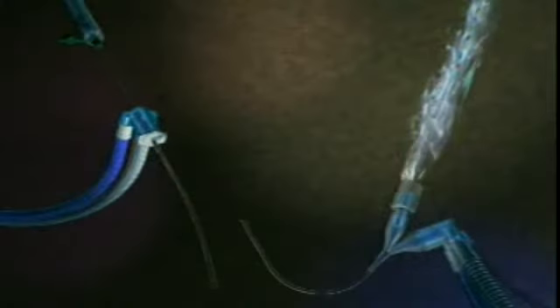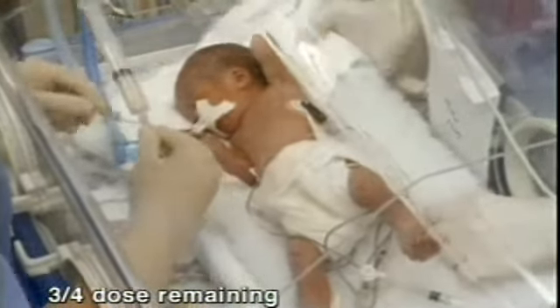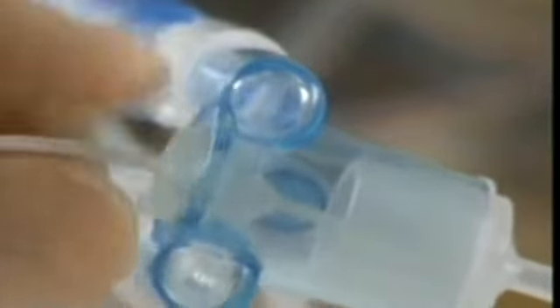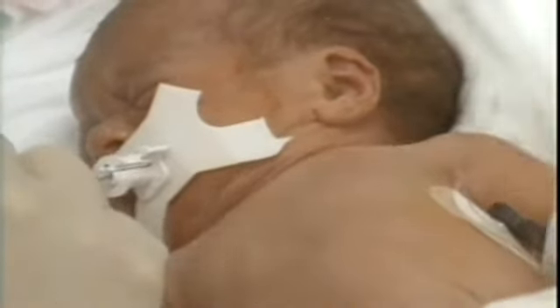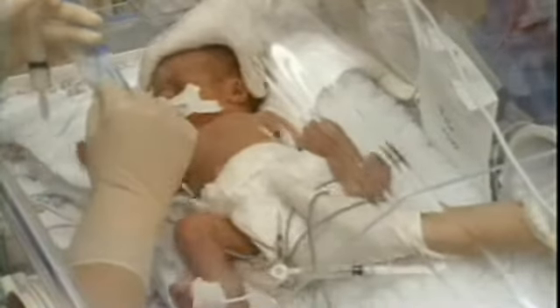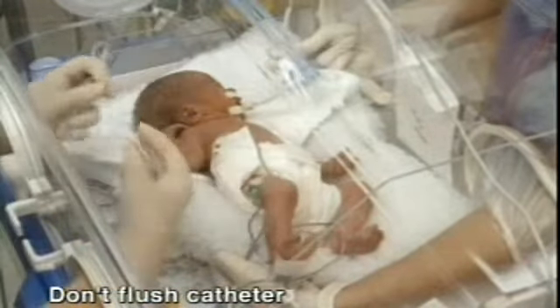In the NICU, Surfactant may be given through a suction adapter. If so, be sure to cut the catheter long enough to accommodate. Gently incline the infant with the head and one shoulder up. You can use the bed to position the infant if you prefer. Administer the first fractional dose. Ventilate for 30 seconds. Then, repeat the process for each of the remaining 3 fractional doses. Reposition the infant before each aliquot. When the final aliquot has been given, remove the catheter without flushing it and ventilate.